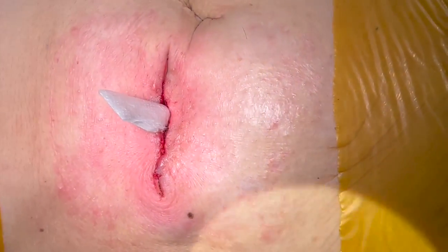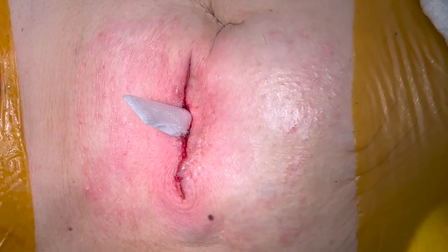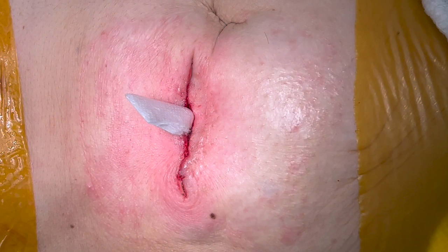In this video, we demonstrate the critical steps for a loop ileostomy closure with stapled anastomosis and linear skin closure.